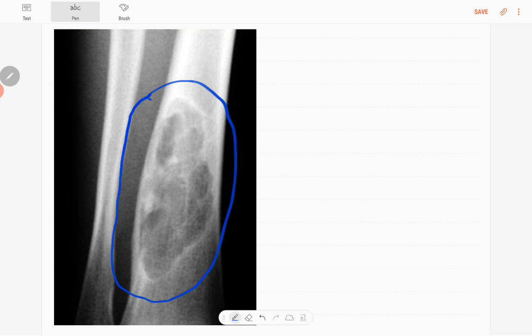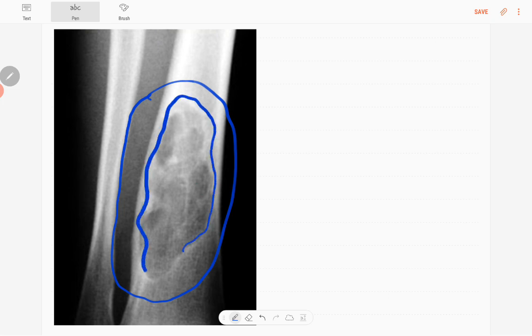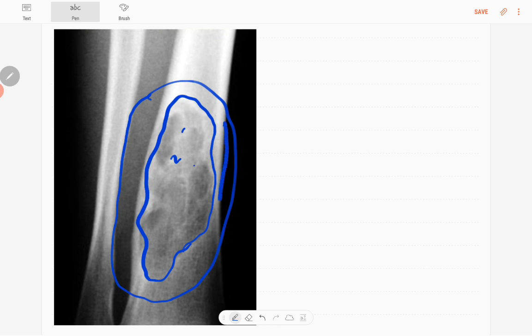It's a well-defined or geographic type of lytic lesion with sclerotic margin. It has a lobulated outline and there's evidence of some sclerotic areas. You can see the expansion of the bone, our cortex is intact.